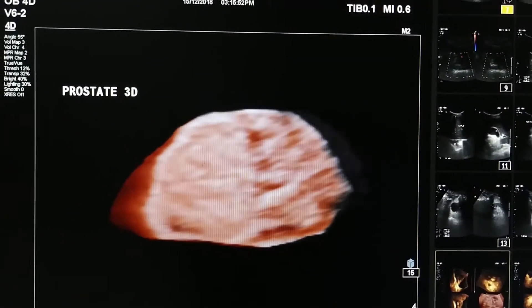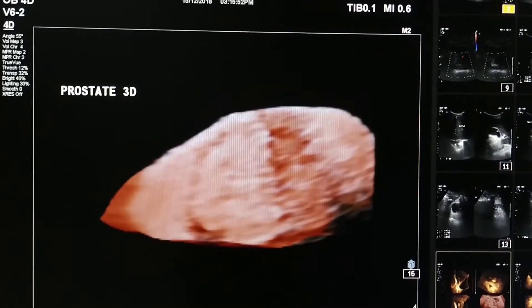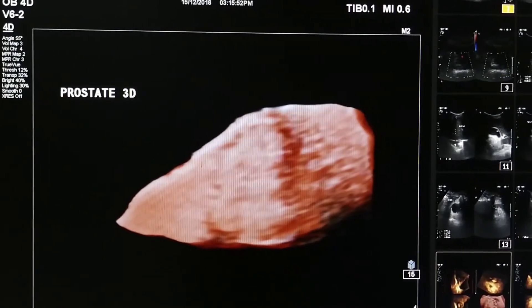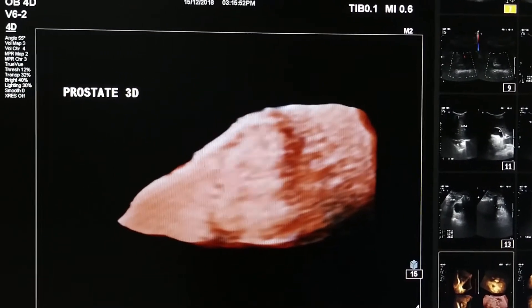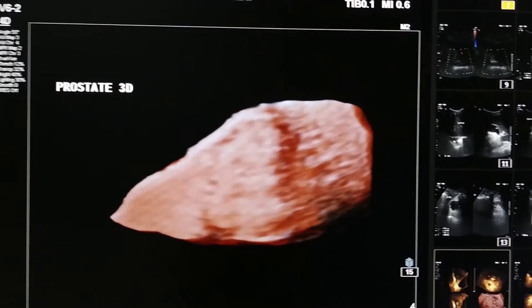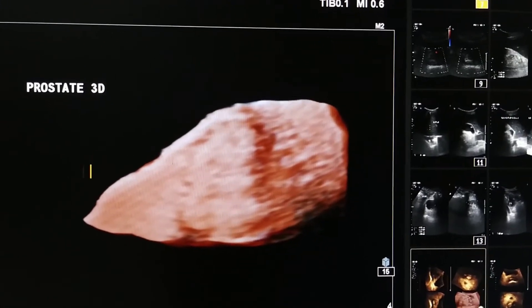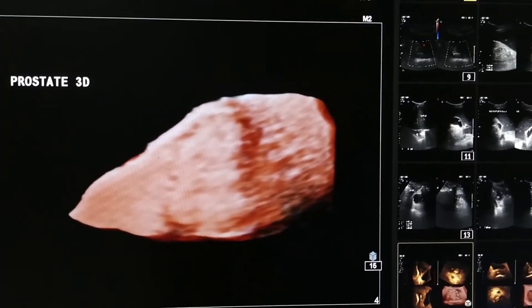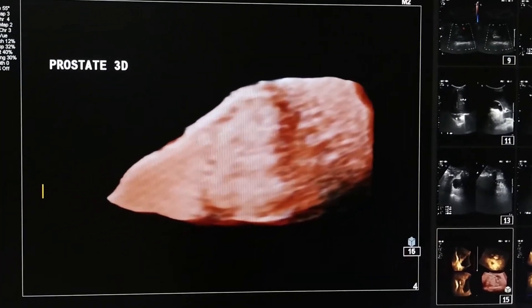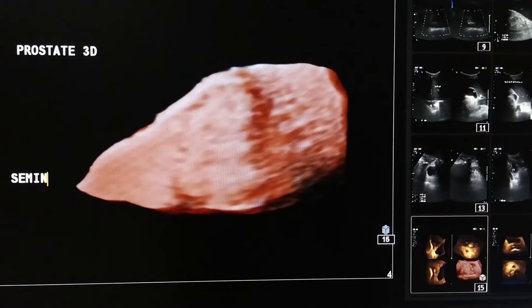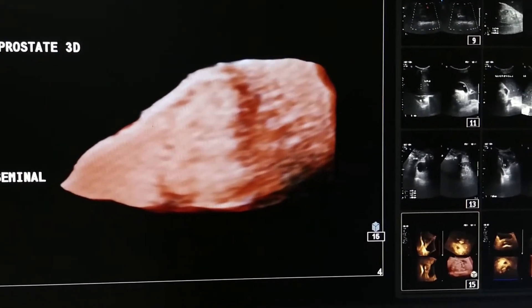I am now rotating the image. You can see a projected area coming out of the prostate. This triangular area is the seminal vesicle.